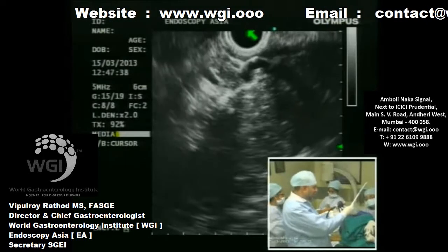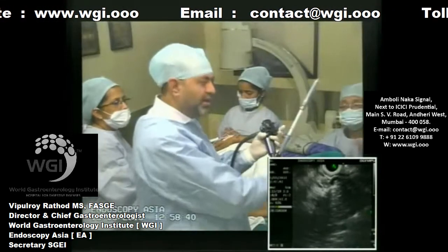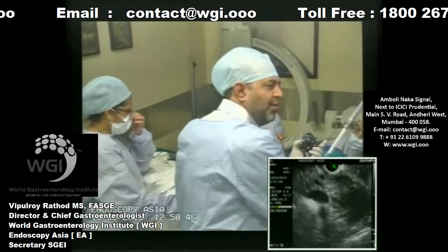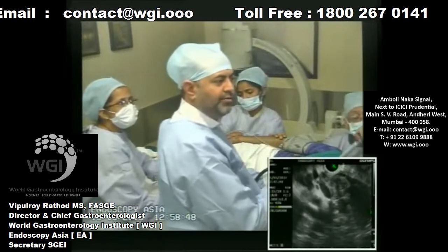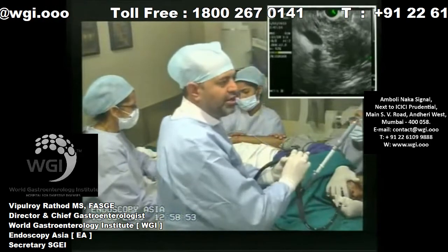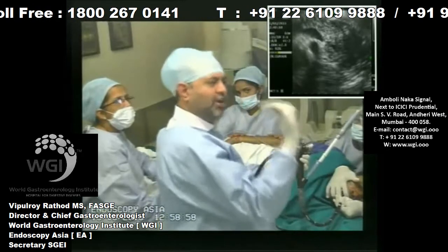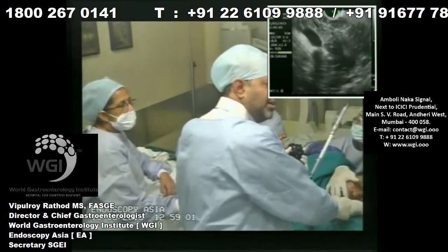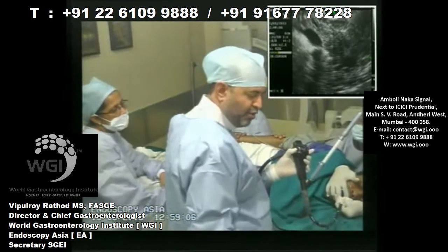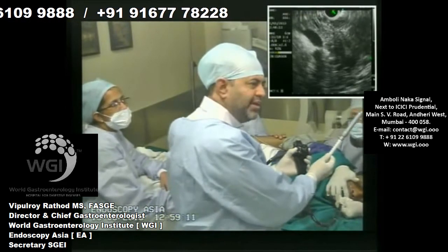So I've lost the lesion, the pancreatic head, out of my sight. And now I'm locking the needle assembly, and now I'll try and get the position back. So this is what I'm going to do now. I'm going to try and get the position back here. Yes, I'm still not in a great position because the needle is holding me. It's upward direction, and I would like to get some material which is reasonable for histopathological diagnosis. So now I'm going to advance my inner catheter.